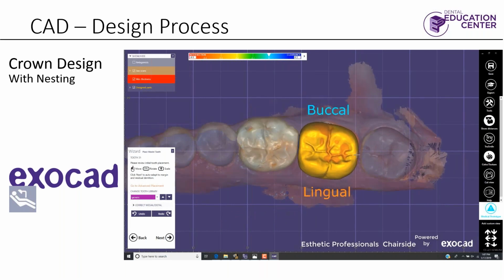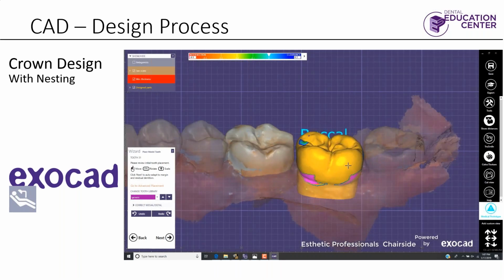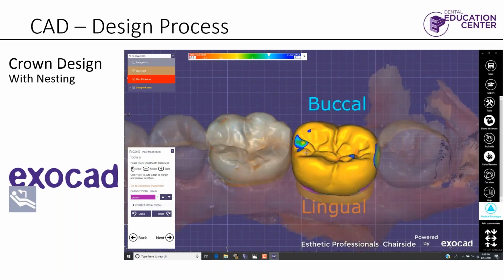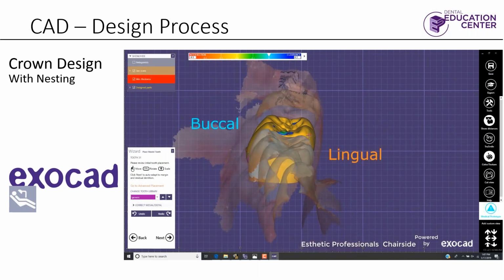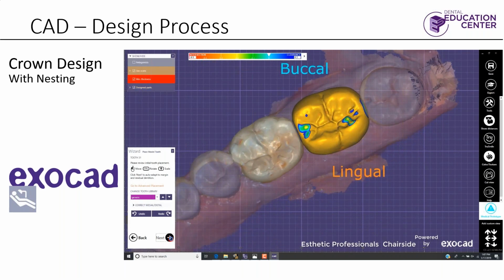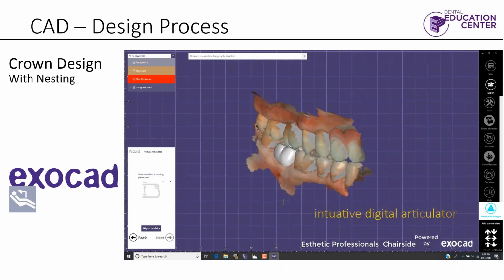The interesting thing about this software, I don't know if you guys know, but it doesn't just propose a tooth that is from a library that you like. It actually takes the dentition on either side of this tooth and basically analyzes it and then finds the morphology in a library, then matches it to be something very similar, which is pretty cool. A little bit of AI there as far as thinking. So it puts it through an articulation process.